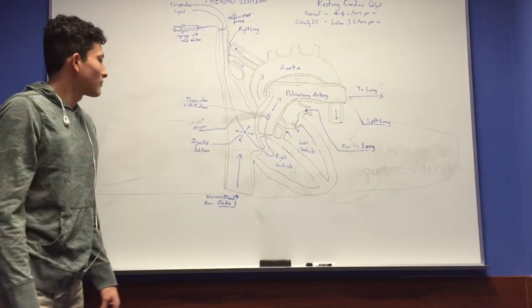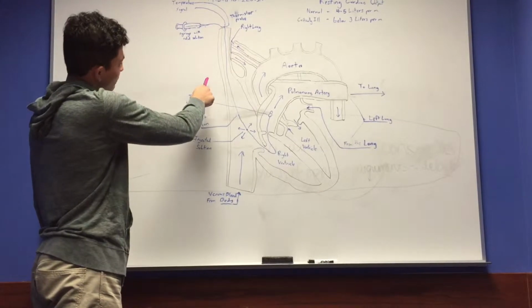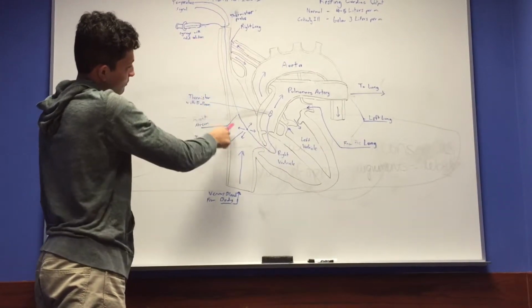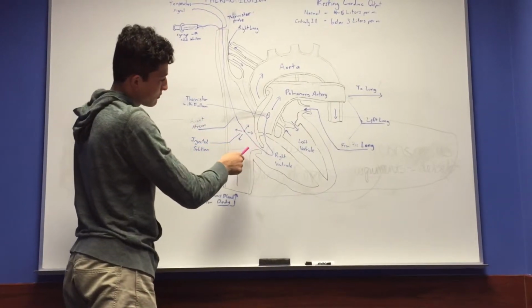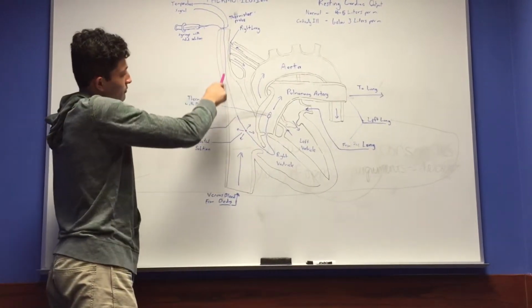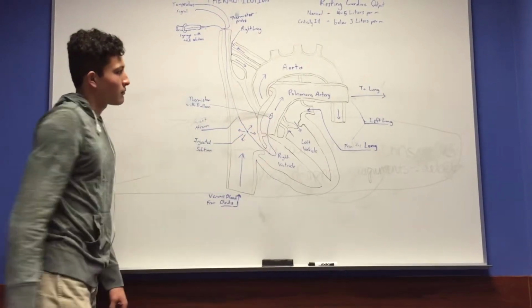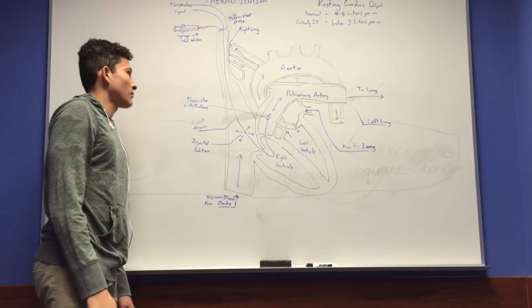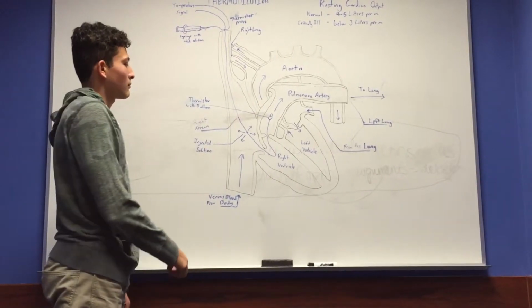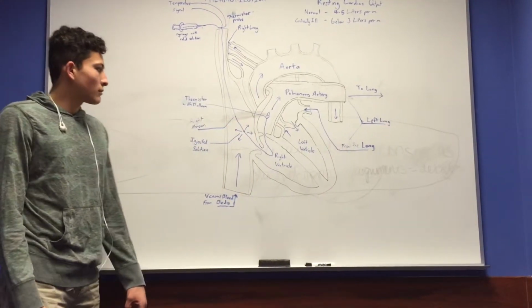The process of thermodilution involves a balloon-tip catheter which is inserted into an arm vein and is carefully guided to the right upper chamber of the heart, which is the right atrium. A thermistor, a temperature-sensitive device, is moved through the right side of the heart and positioned a few centimeters into the pulmonary artery. Then 10 milliliters of cold D5W is injected into the atrium. As the cold D5W mixes with the blood in the right heart, temperature fluctuations in the flow are detected by the thermistor.